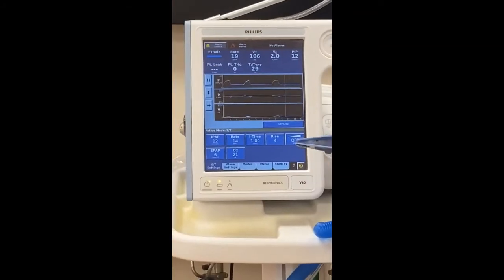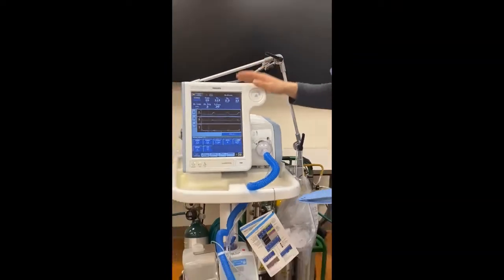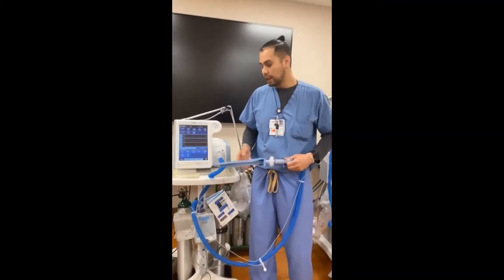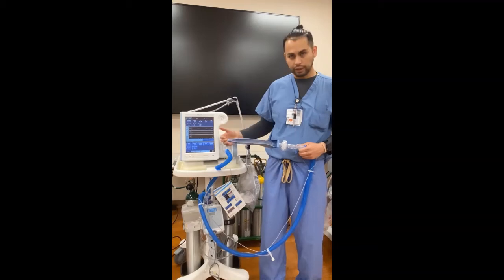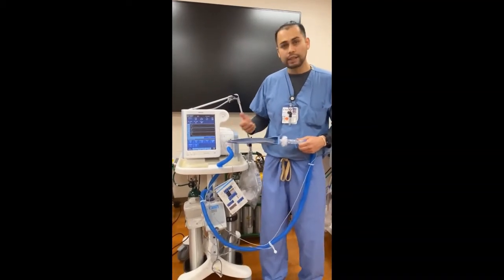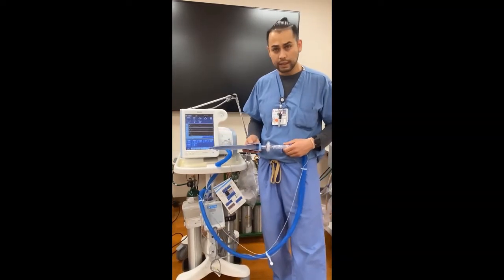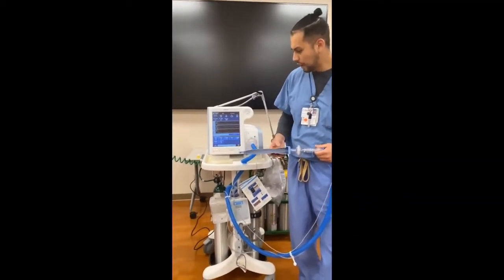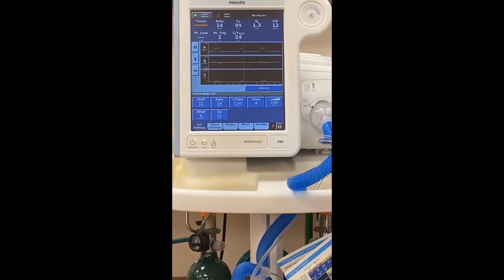We do have a backup rate. Now this rate is not like a ventilator. When we set a rate on this machine, the patient will not be getting that set rate. In case the patient is breathing less than the set rate, that's when the backup rate will kick in. If the patient is breathing 16 breaths per minute and the set rate's at 12, the backup rate is ineffective. Unless the patient is breathing less than that rate, the backup rate will kick in for the patient. And we also have O2, which is our oxygen concentration. That is the amount of FiO2 that we can deliver for the patient.